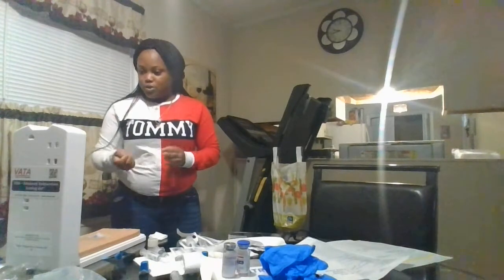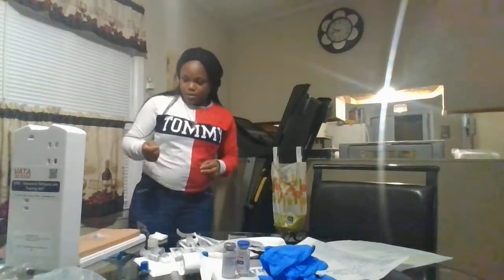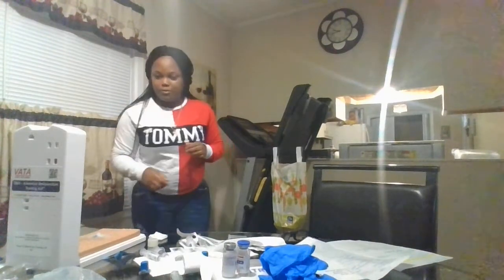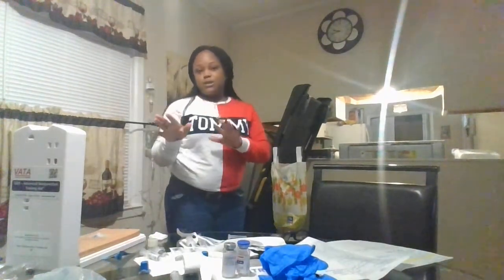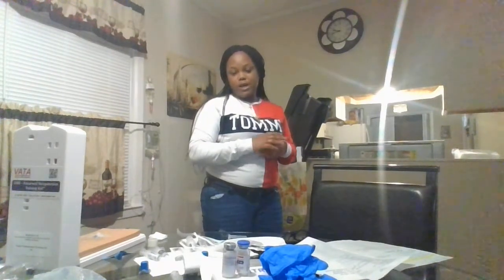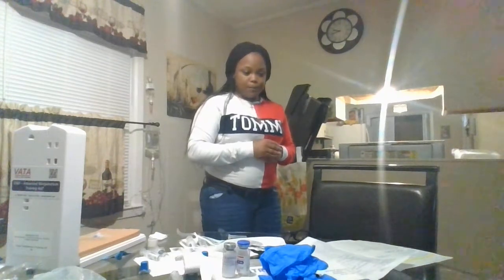Use your call light if you need me. Make sure your bed is still locked. The side rails are up. Okay, and I will be right back. And I'm going to document the date and time, the size of the catheter, and how the patient tolerated it and the site. All right, I will be right back.